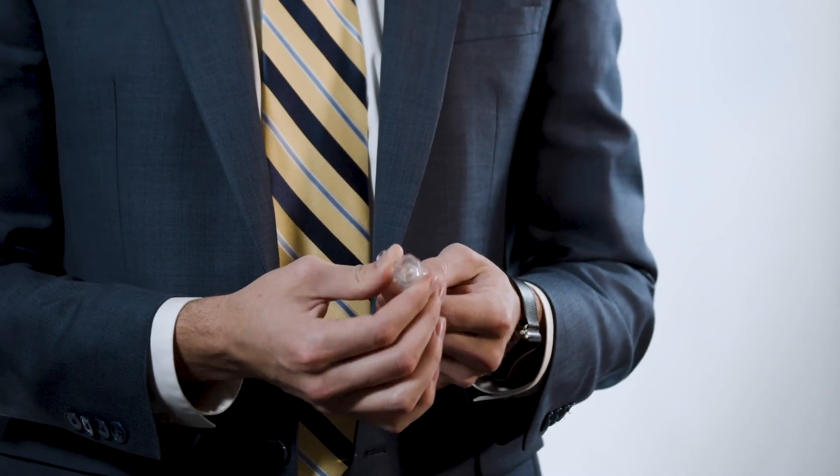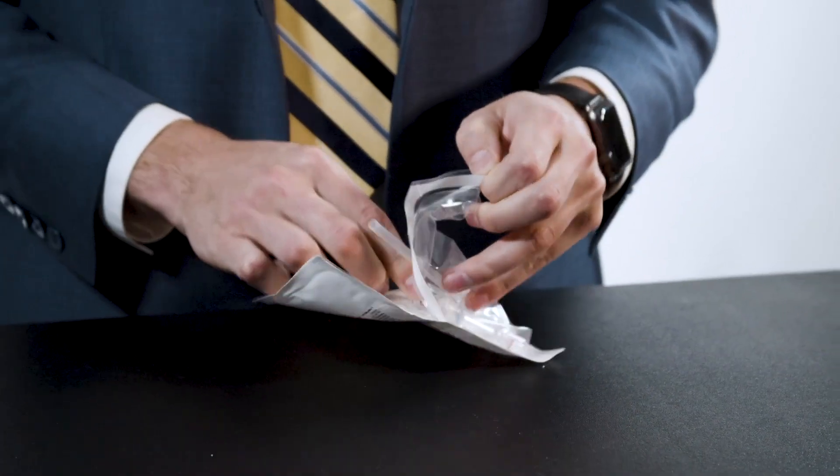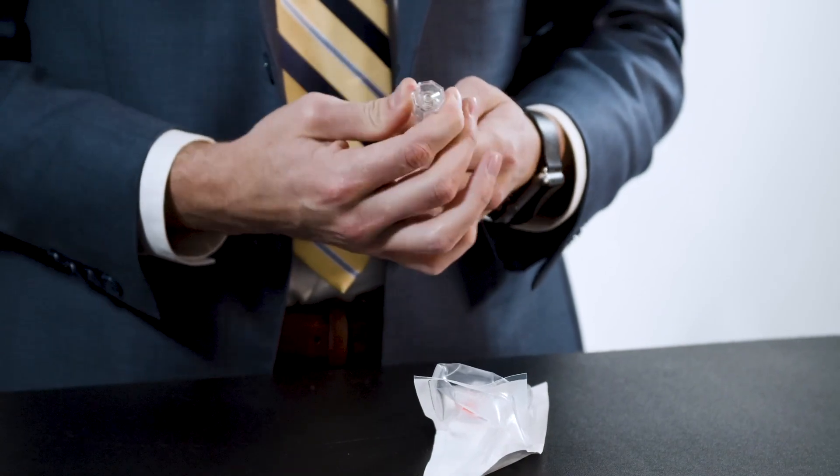The PHD features both the standard compression seal as well as a secondary push and release bleed back seal. The standard compression seal can be opened and closed by rotating the top of the device. It is also important to point out that when opening the package, rotate the valve counterclockwise to ensure the valve is completely open.